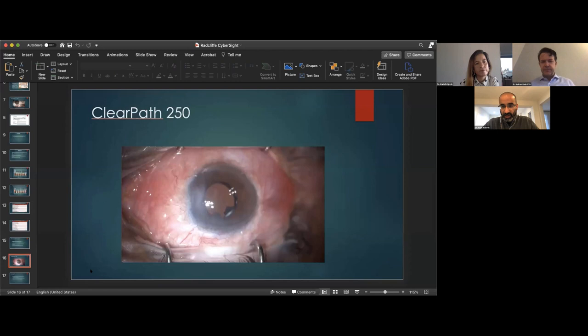And the final thing I wanted to say is I think you can sometimes get away with less prednisolone if you glue, and patients may be less prone to rub because the sutures do cause that foreign body sensation and the glue typically is comfortable.